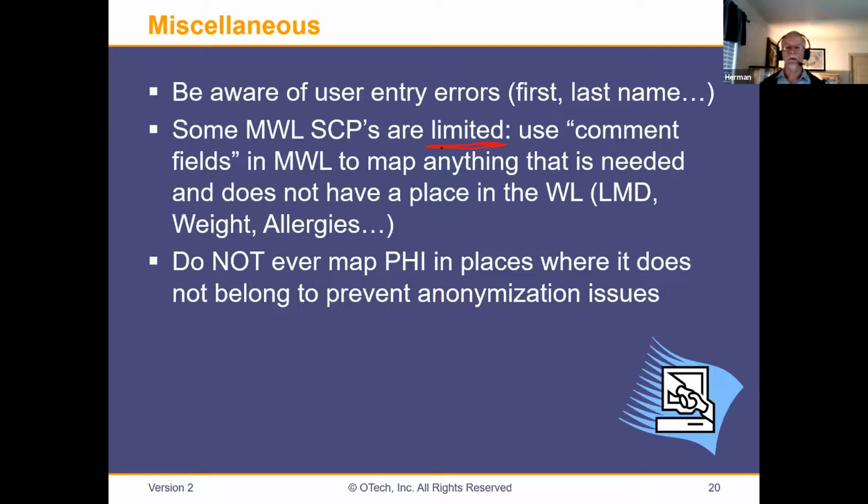And guess what? Maybe your worklist doesn't have a place for that. Maybe there's no place for LMD or weight or something like that. So you can use creatively. Many times, almost always, there's a patient comment field. So use the patient comment field, and you put in, for example, the weight, right? So allergies and stuff like that.